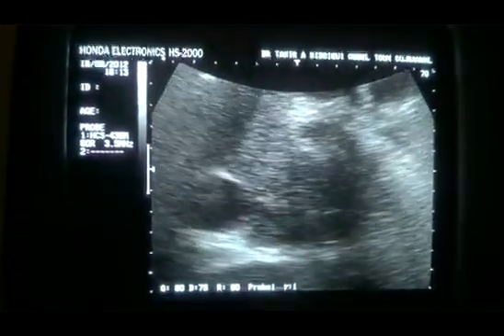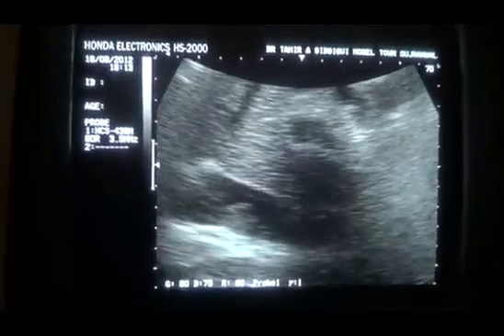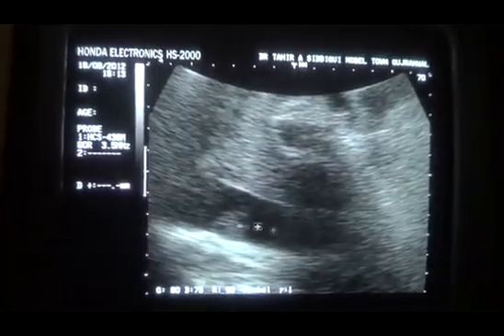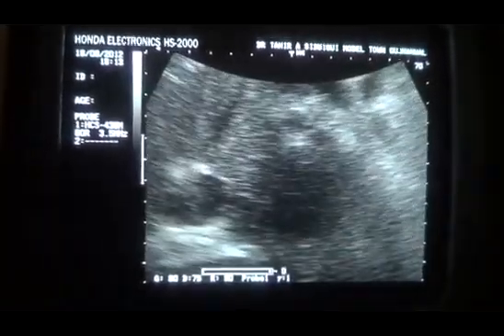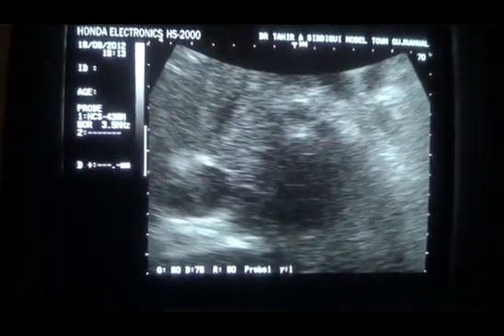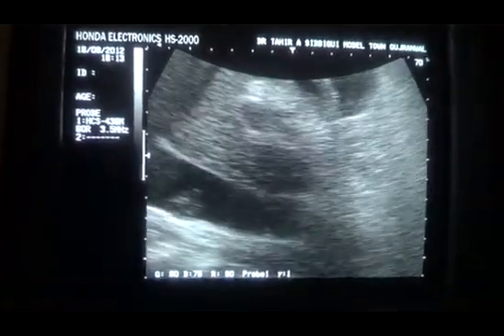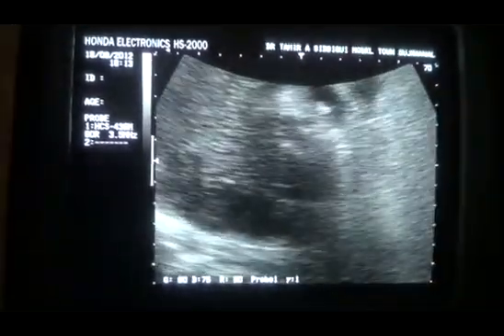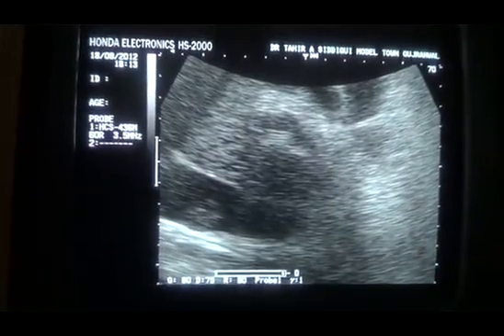And why it is really the IVC — see the curve. This is the typical curve of the IVC. And you will see that this left hepatic vein will be entering the IVC. So there is a clot formation within the IVC confirmed in this section of the study.